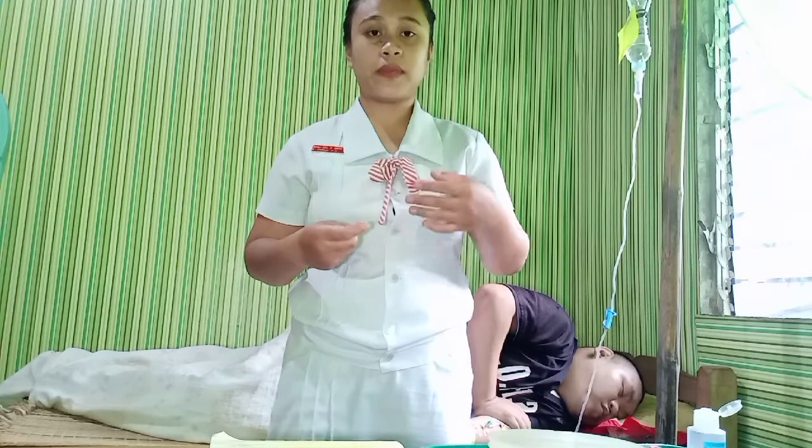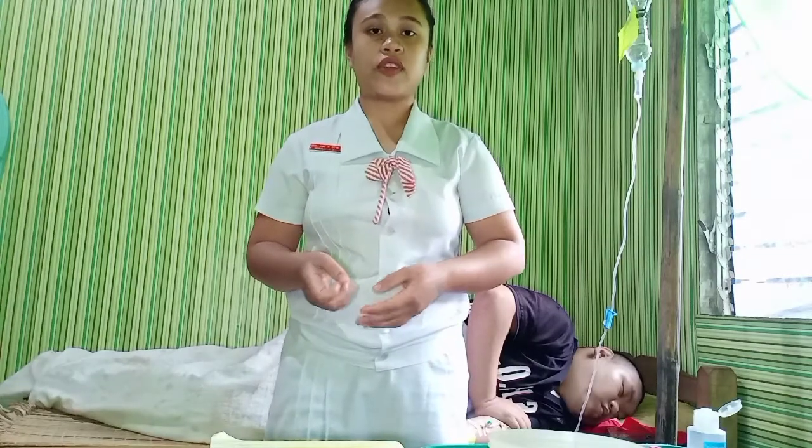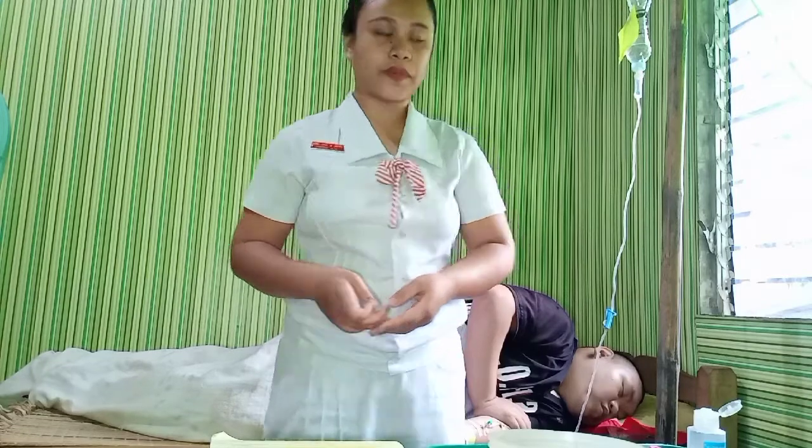So after moving into the patient's room, we need also to introduce ourselves back and to explain the procedure to the patient to gain his cooperation.